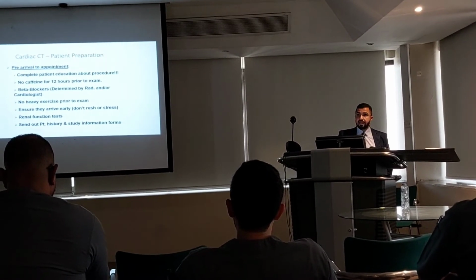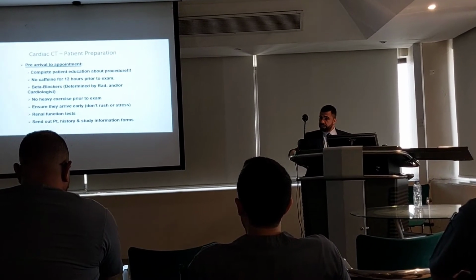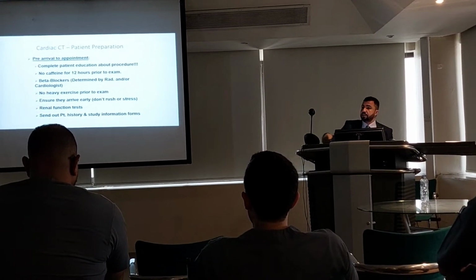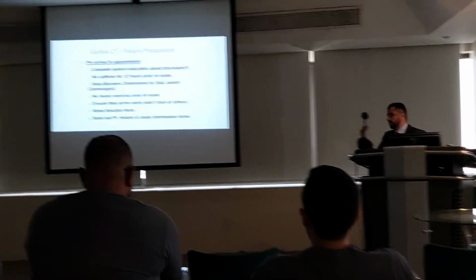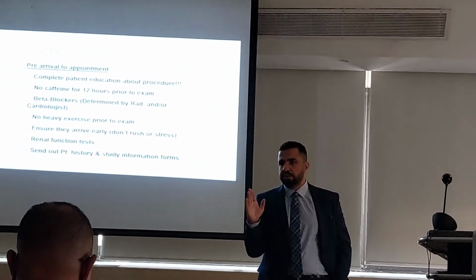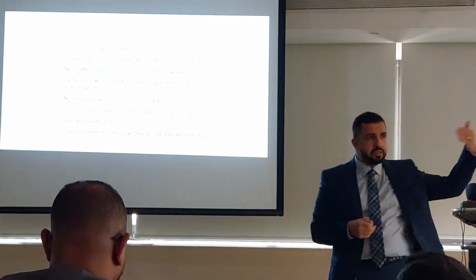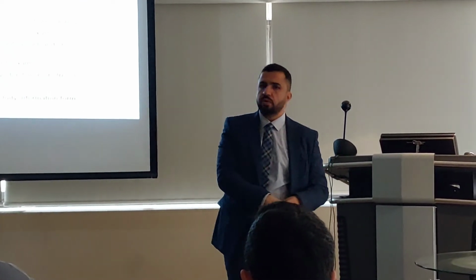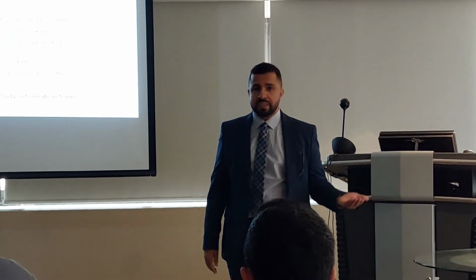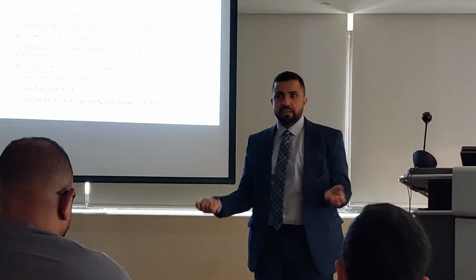Beta blocker. That's why we need to ask the patient, check the patient's heart rate and decide if we will give him a beta blocker or not. Say he's a young patient, and the heart rate is high. So I know I will give him a beta blocker. Why should I ask him to come and wait in my department, and give him a beta blocker maybe for 1 hour or 2 hours sometimes? So take these tablets. The cardiologist says it's safe.